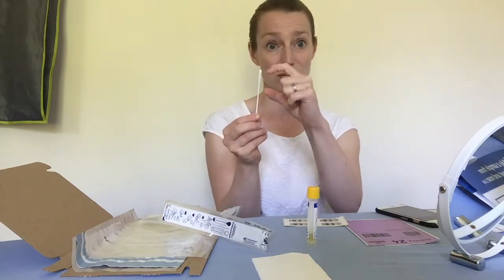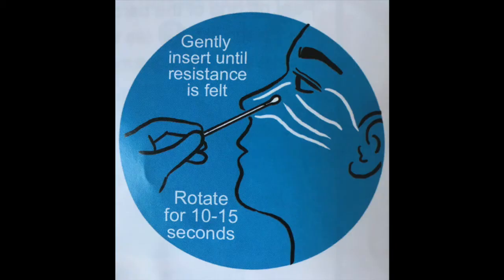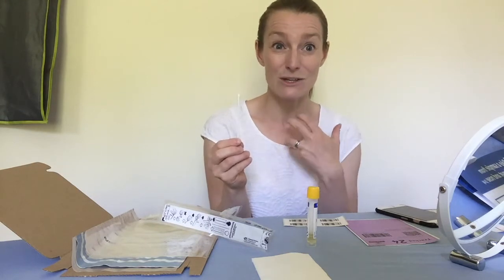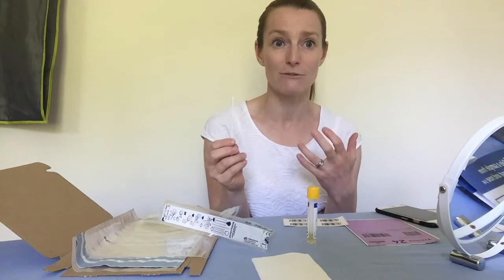Put it about one inch into your nose — which is about that much — for 10 to 15 seconds. It's a slightly funny feeling; it does make you gag a bit and it can make you sneeze. It's a bit uncomfortable, but it shouldn't be painful.